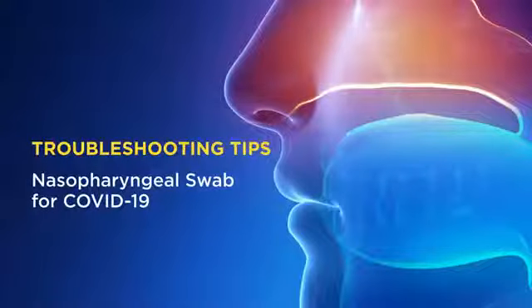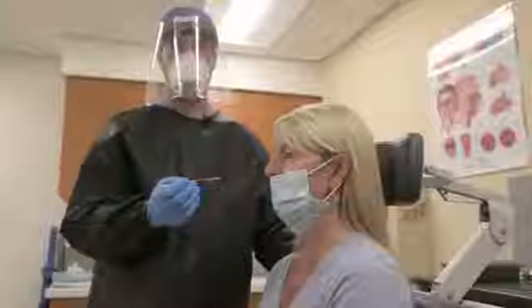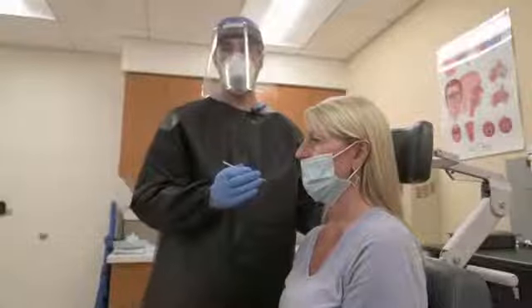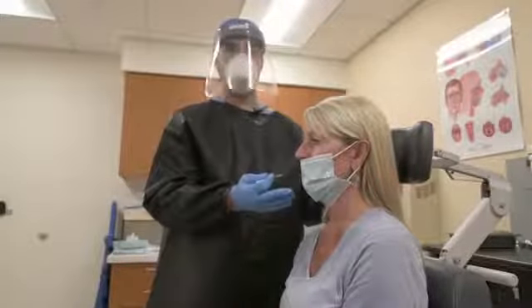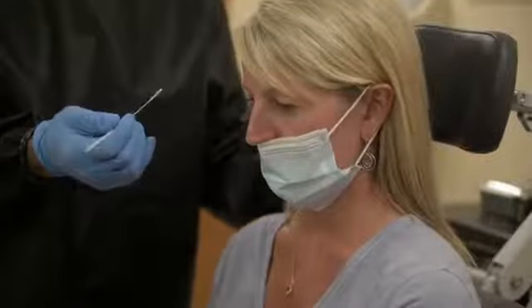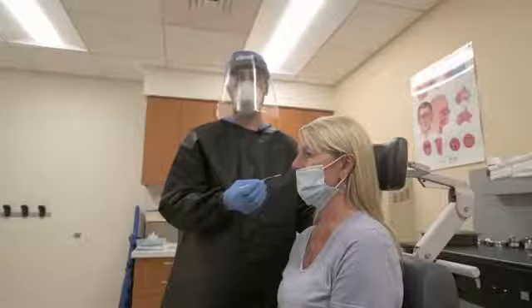One of the problems you may experience during testing is a patient that moves their head while the swab is in their nose. The appropriate position for the patient's head during this procedure is a neutral position. If the patient is extended or even flexed, you're going to find it very difficult to reach the nasopharynx, and so the neutral position is key.